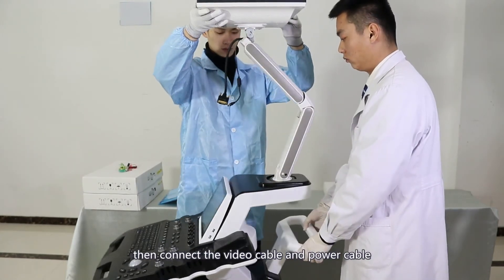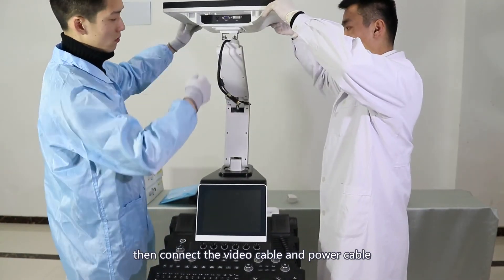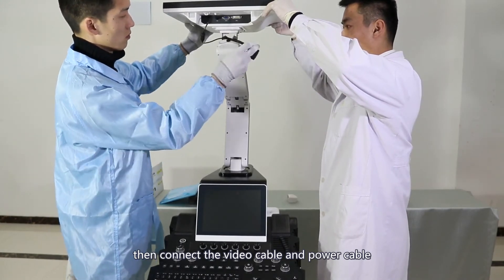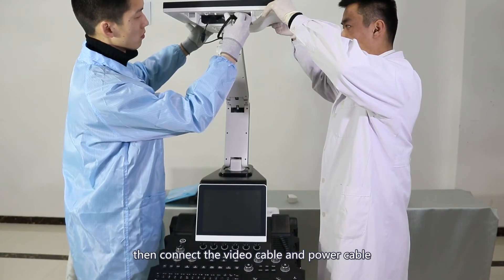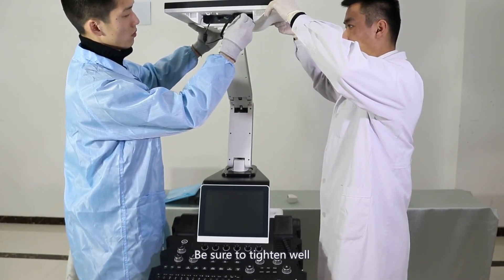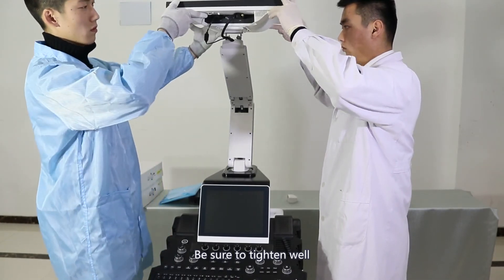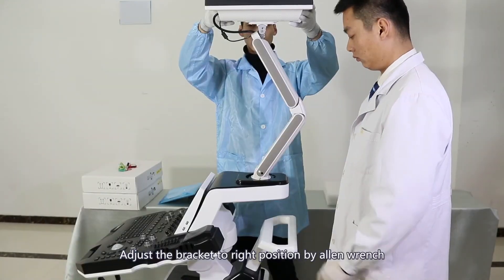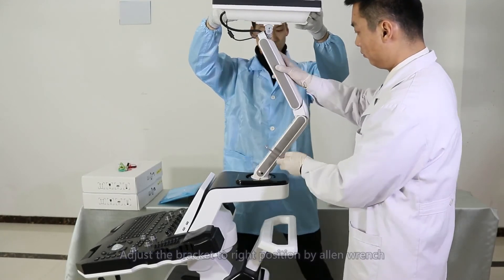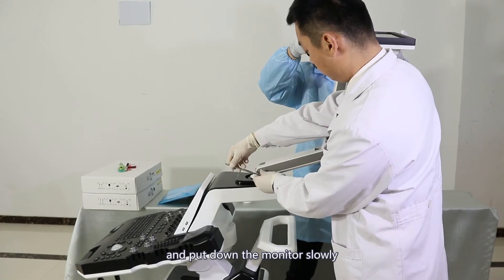Connect the video cable and power cable. Be sure to tighten the wires. Adjust the bracket to the right position using an allen wrench, then put down the monitor slowly.